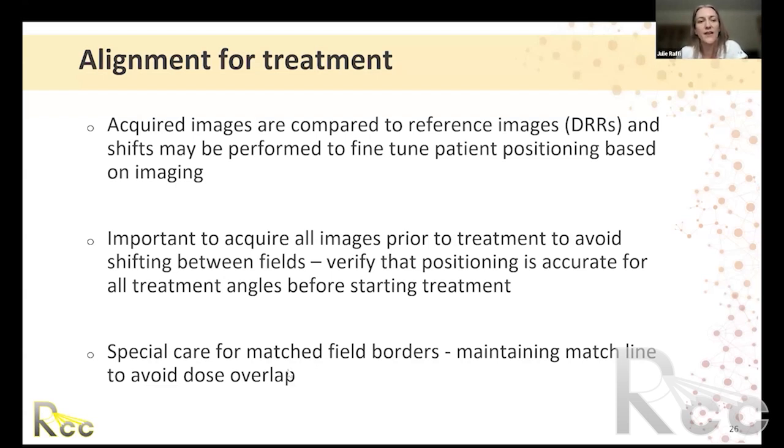And then I put a note here to take special care with matched field borders. If we have a case where we're matching fields and we have a match line that needs to be maintained, you want to be careful to maintain that match line and not apply shifts between fields that are going to cause dose overlap. Sometimes it's better to have a little bit of patient misalignment, but maintain that match line rather than shifting into your other treatment field. So if you're going to be matching field borders, again, it's important to image both fields first before delivering one of the treatments and make sure that match line can be maintained.